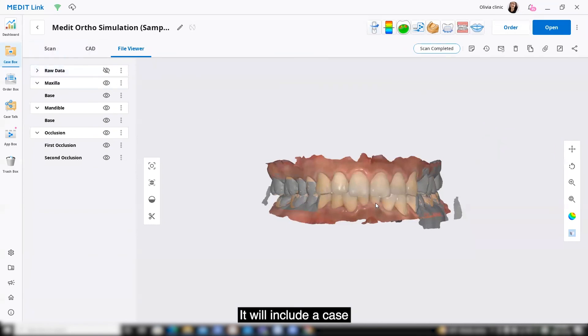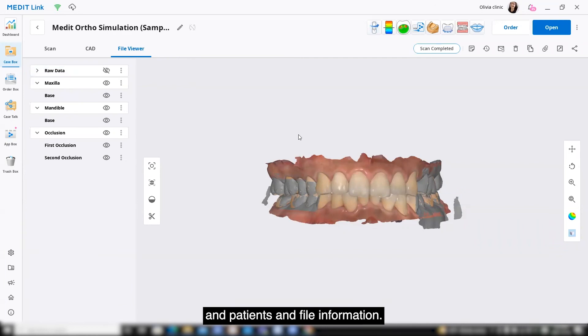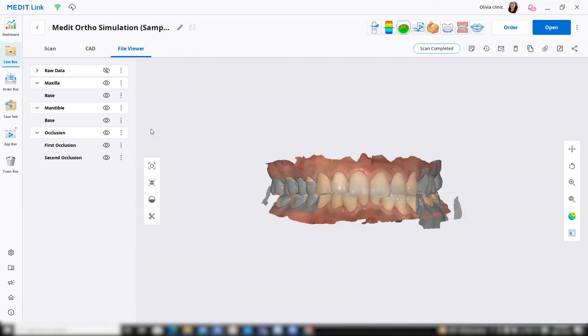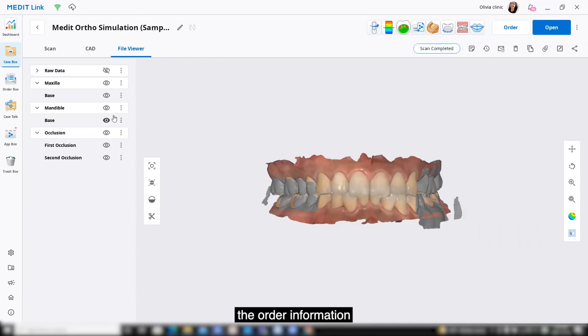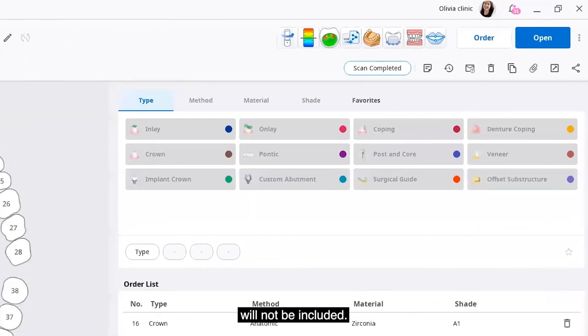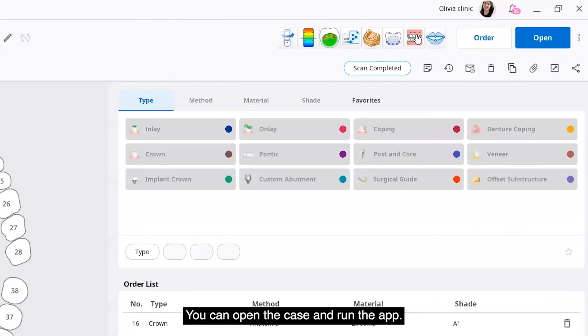It will include a case and patients and file information. But please note that the order information will not be included. You can open the case and run the app.